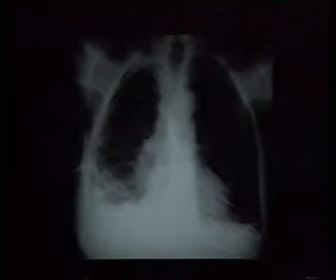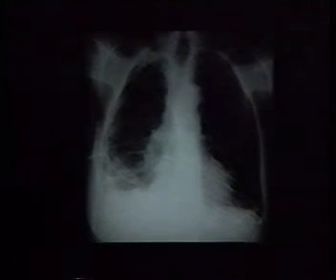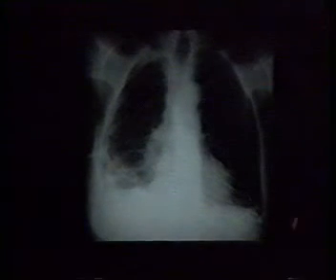Using the ultrasound guidance and marking the patient, as you can see here, these strips of echolucent areas represent a metallic clip that we use to localize the proper needle entry site. We then place the catheters percutaneously, and here's a follow-up image of the patient showing that the right pleural effusion, although not completely drained, has diminished significantly, and that there's a very minimal or absent left pleural effusion.